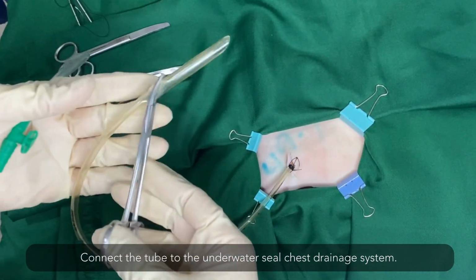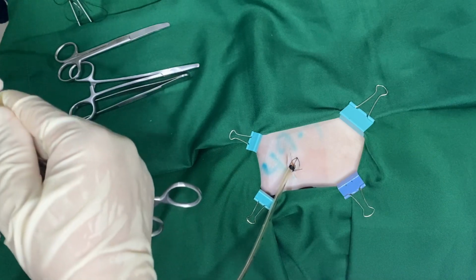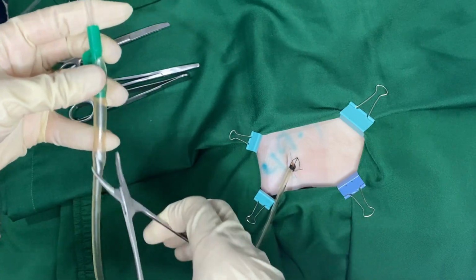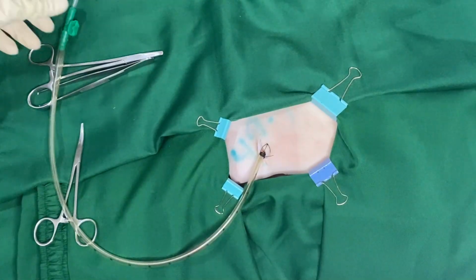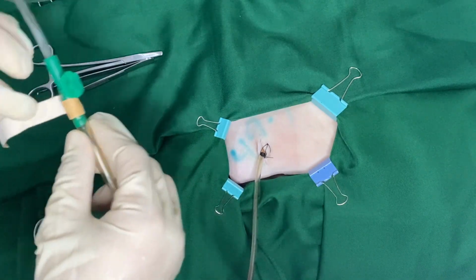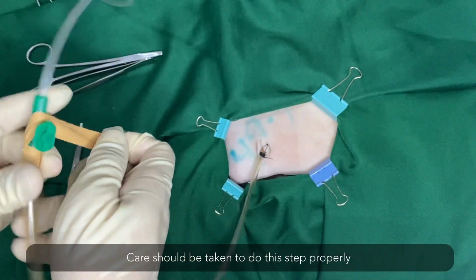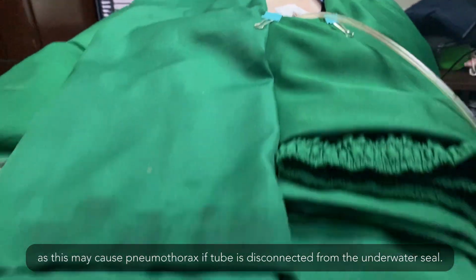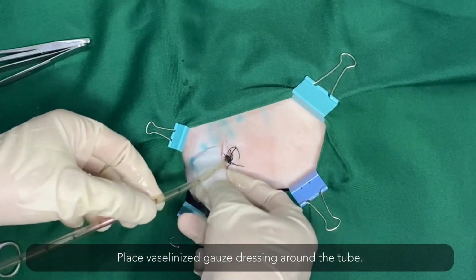Connect the tube to the underwater seal chest drainage system. Care should be taken to do this step properly, as this may cause pneumothorax if tube is disconnected from the underwater seal. Place Vaselinized gauze dressing around the tube.